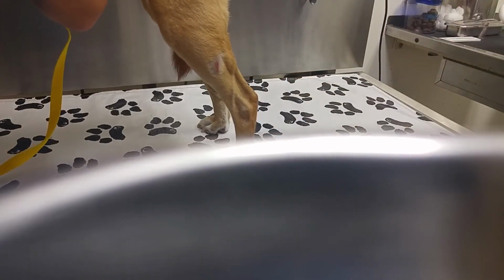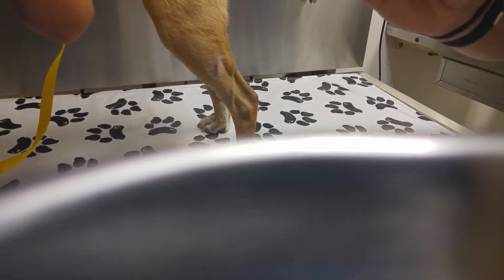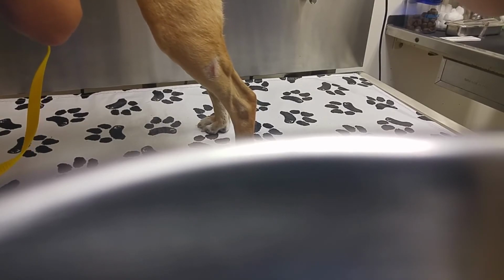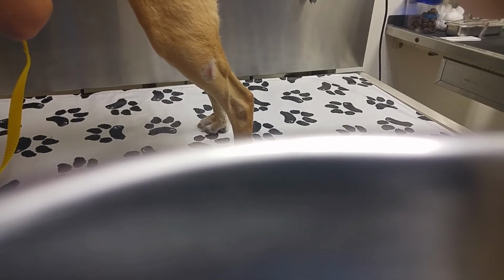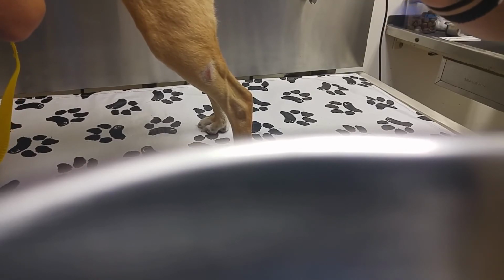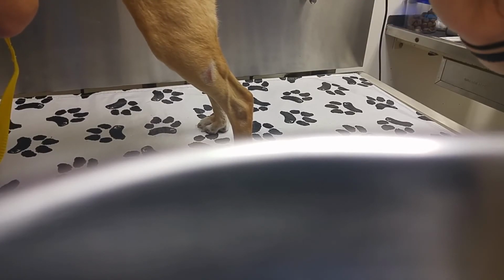I got a good sample just like that. I'm going to take it onto my slide, get it on there, and spread it out a little bit so there's not huge chunks to look at. That way it is prepared to look at under the microscope, and we'll look for any mites or any organisms that should not be there, including mange, which could be both Demodex or Sarcoptic mange.